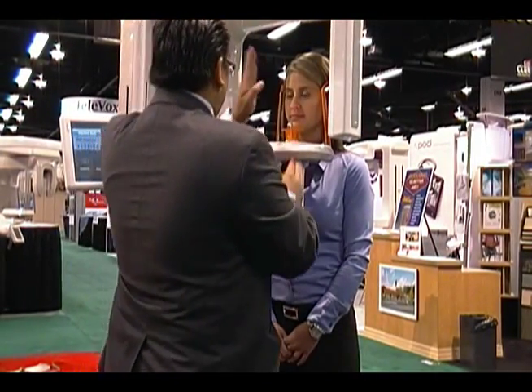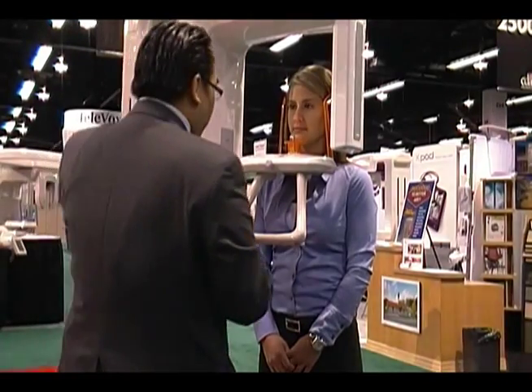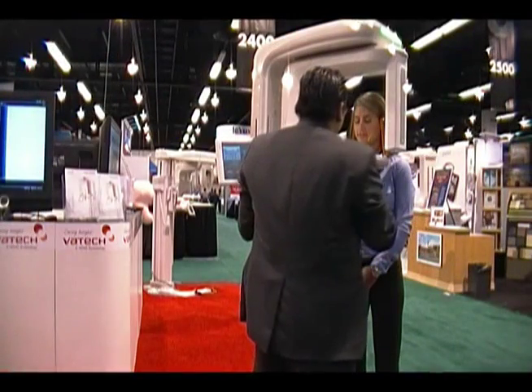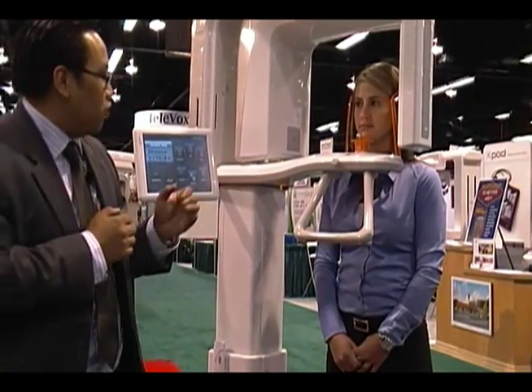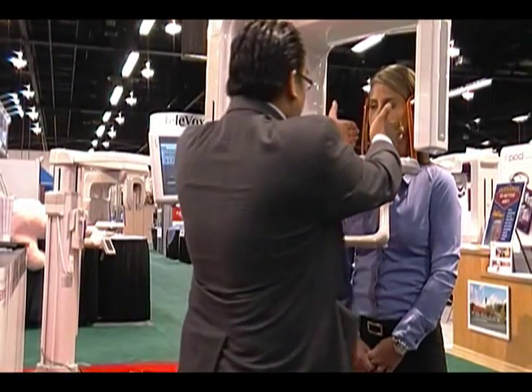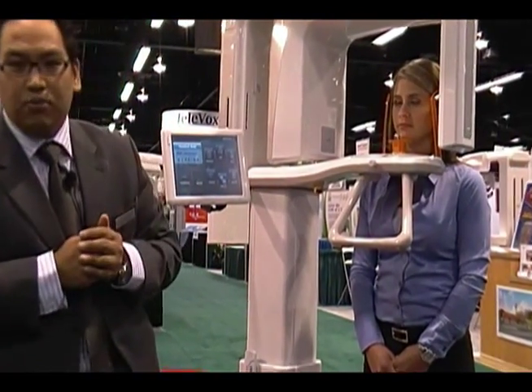As you can see, we have the laser alignment. We have our frontal, the mid-sagittal, a horizontal line for your Frankfurt plane, and also our cuspid. The benefit of having the frontal view is that you can position the patient with a frontal perspective, so positioning is going to be more accurate and consistent.